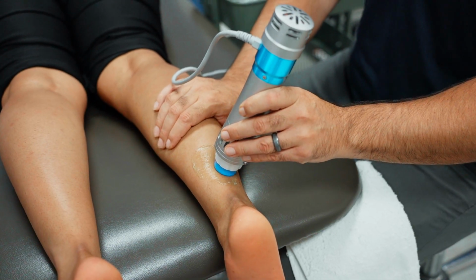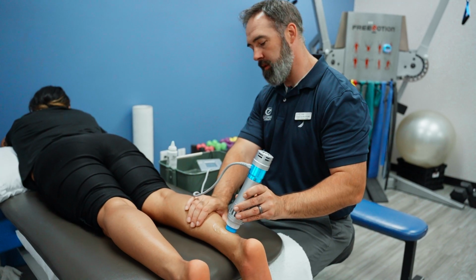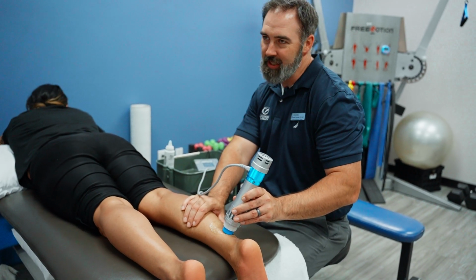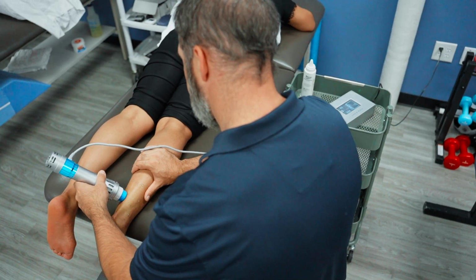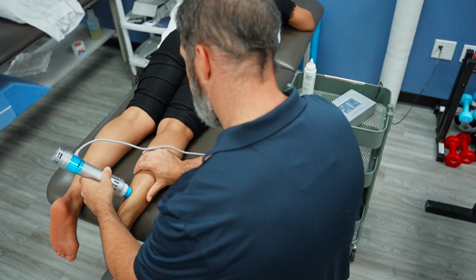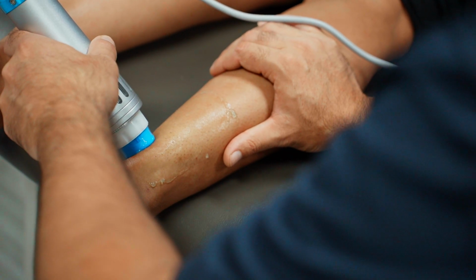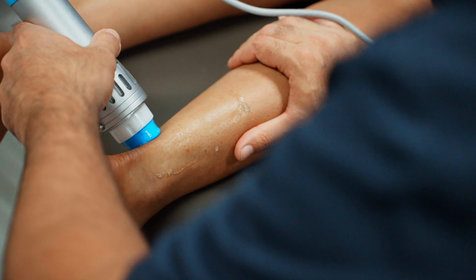So the protocol for this is to do about 1,000 strikes, and this is at 3 hertz, so 3 strikes per second. Or pulses, I guess we could call them pulses. You can expect some soreness, like workout type muscle soreness, or sometimes it can be a little tender to the touch just because it gets hit a bunch. And then you'll expect a reduction in symptoms because it's helping to improve the quality of the tissue in the area and reduce chronic inflammation.